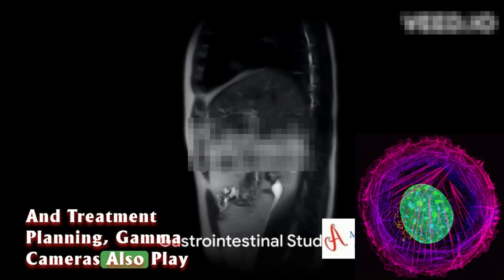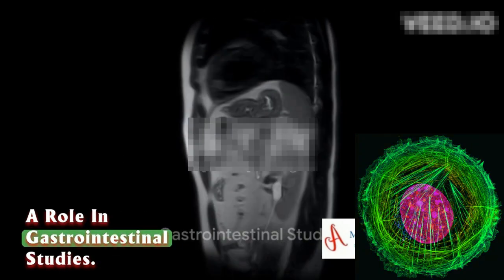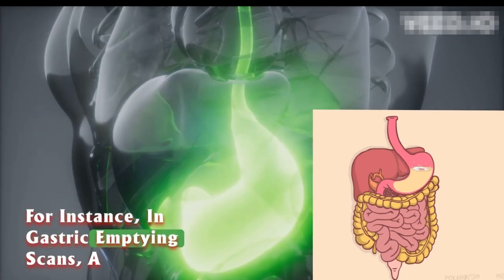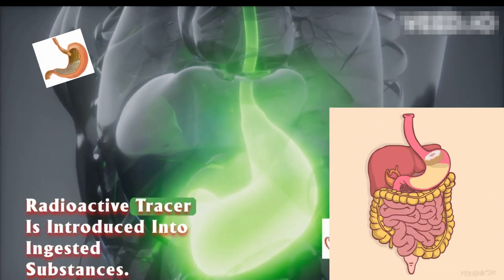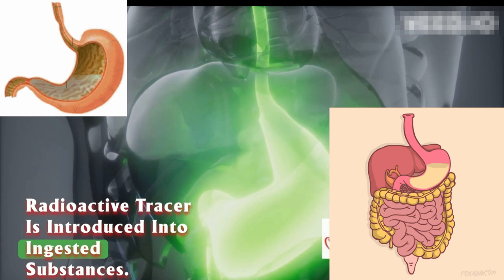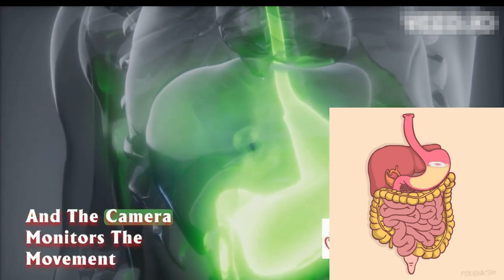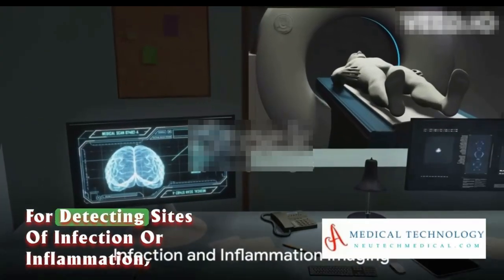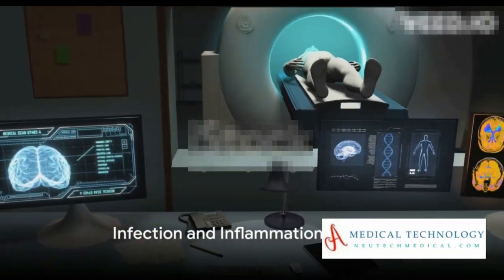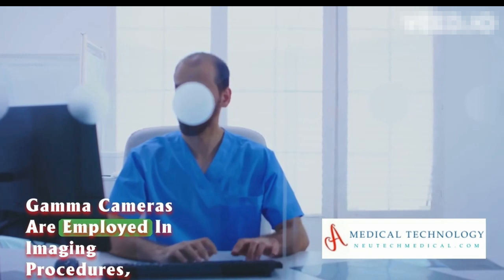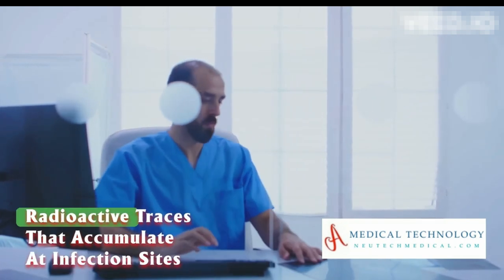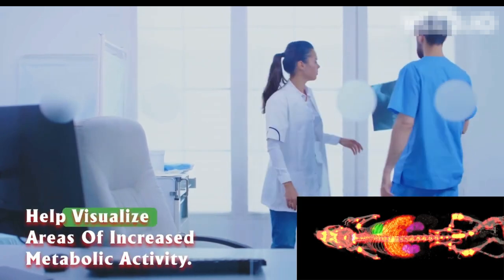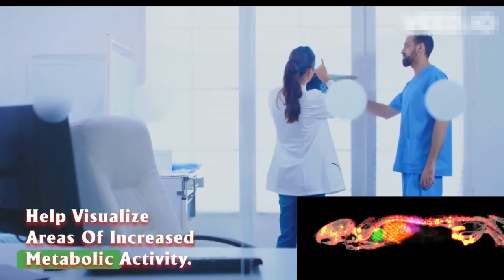Gamma cameras also play a role in gastrointestinal studies. For instance, in gastric emptying scans, a radioactive tracer is introduced into ingested substances and the camera monitors the movement and function of the digestive system. For detecting sites of infection or inflammation, radioactive tracers that accumulate at infection sites help visualize areas of increased metabolic activity.